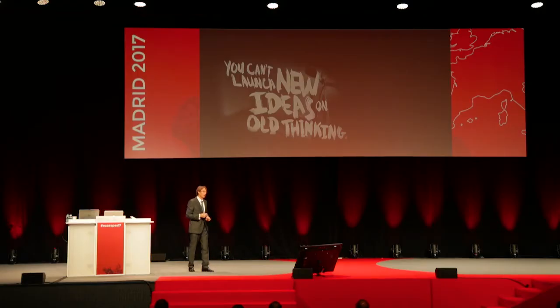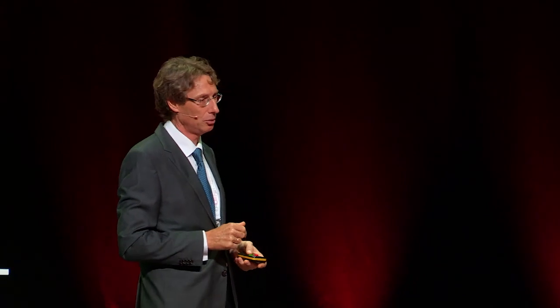So the message is that you can't launch new ideas on old thinking. We started in 2008 with PEEK because we started in 2006 with zirconia implants, and our mind was open for a metal-free treatment approach. That's really the reason why we saw PEEK, and now we are happy, and we are not only doing PEEK framework bridges on our zirconia implants and doing 100% metal-free restorations. So now we see that PEEK is the best material on titanium implants too.